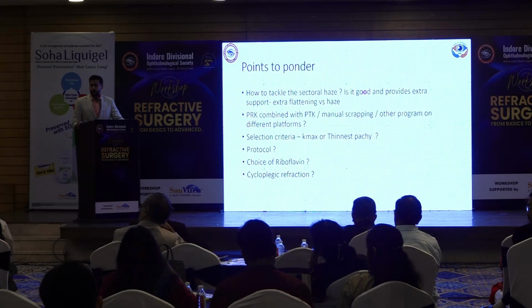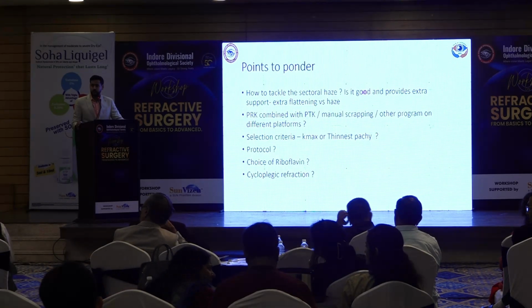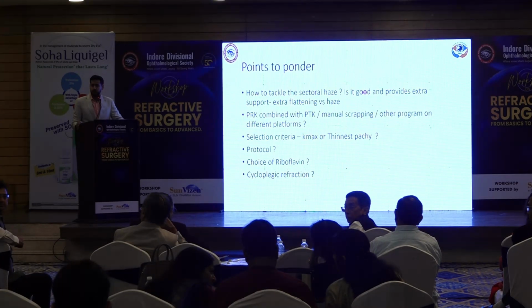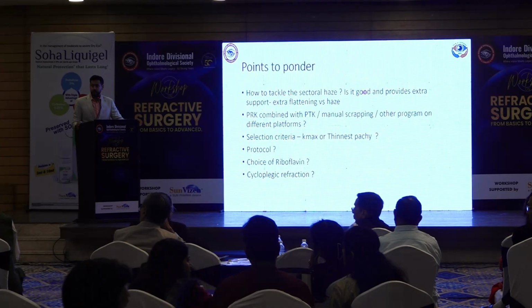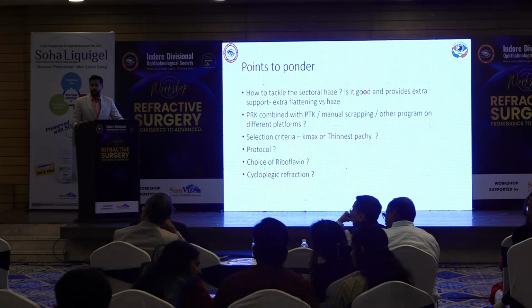The only thing is that for peripheral scarring, try differential mitomycin, you will reduce it. When you get more scar, keep them on long-term trehalose, omega-3, resveratrol kind of a thing so that they balance it. Completely boldly try to offer the combined procedure as the way to go. Cross-linking alone doesn't work at all because it's not improving anything to do with the quality of vision.